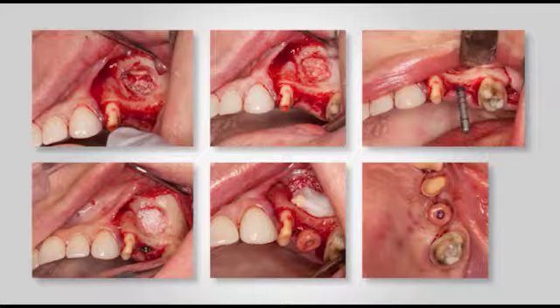So there was no surprise that the implant was placed in just the perfect spot for us. And then he actually took a little soft tissue from back behind the second molar, which helped my preparation, my margins. He sort of exposed more of that second molar that was totally covered back there and said, I can do this for you too. Again, I would have never thought of that. That's the beauty of sitting down and going over everything with the specialist.